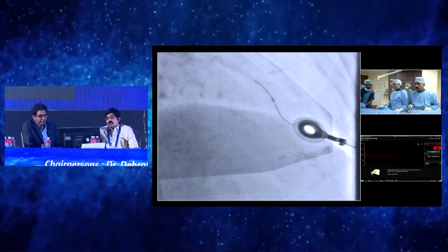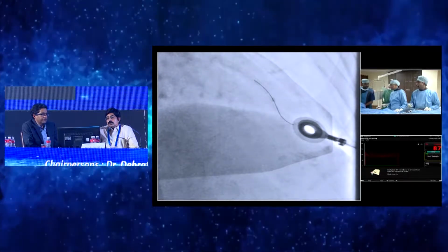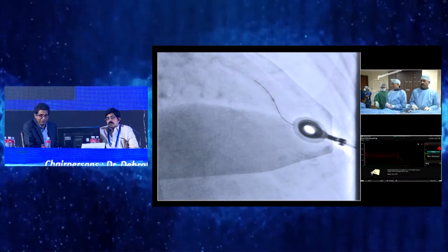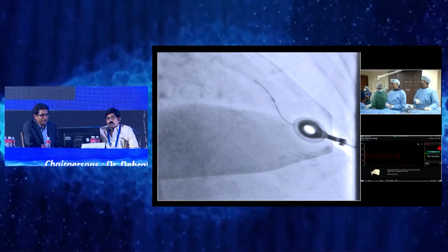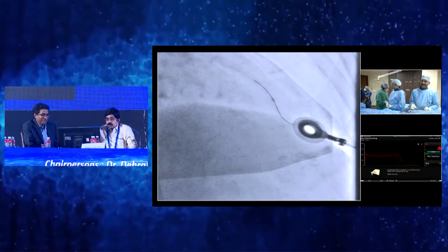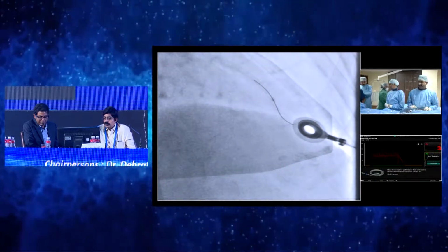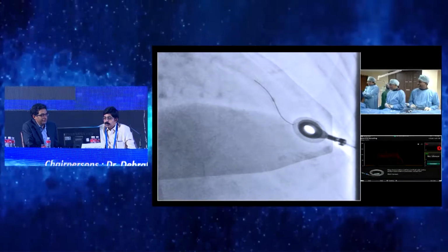So Dr. Srinivas, we have 2 minutes for you, and then we'll switch to the other lab, but in 2 minutes I'm sure you'll be able to calculate QFR, that is a test for a Medis employee over there. So actually, our chief technician Lakshmi herself is doing it. Oh, good. That's very good.